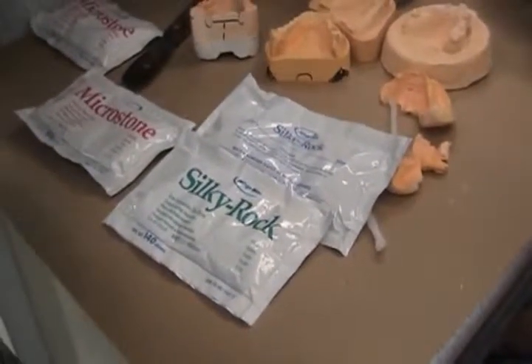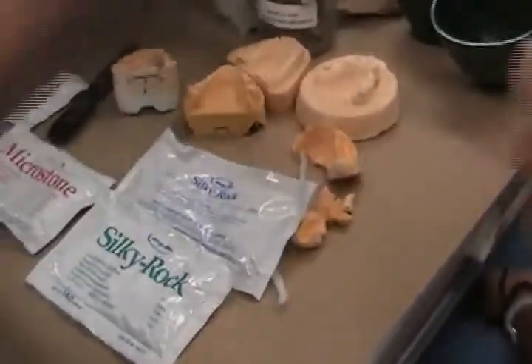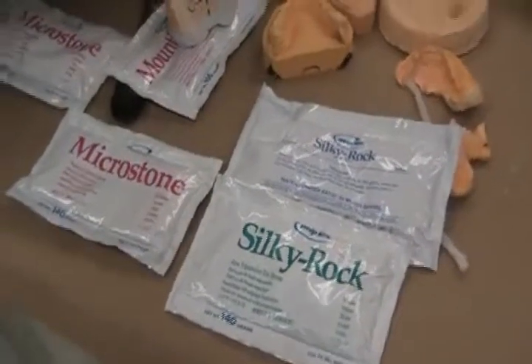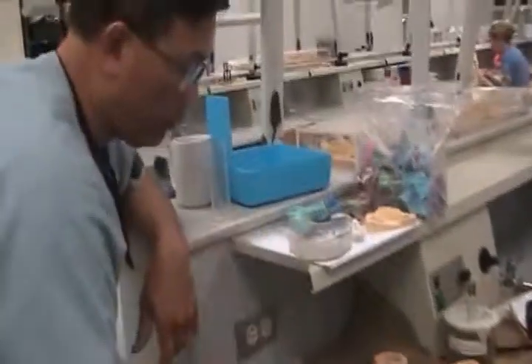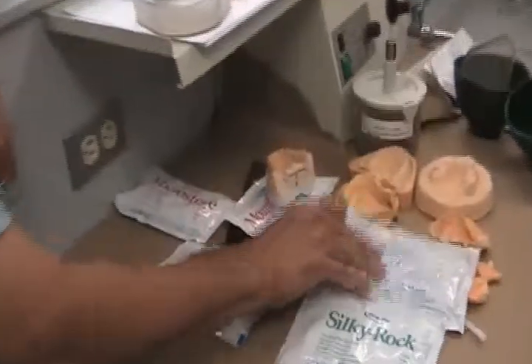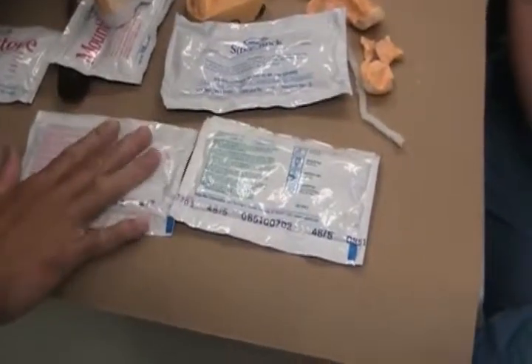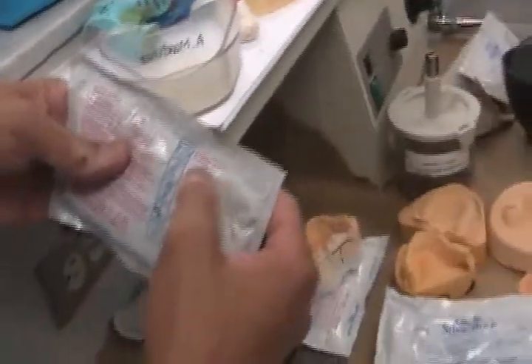I think we learned what was for what, but they never actually pointed out the packages — there was no connection. Each box has a vial so you can measure the prescribed amount of water. This is important: take time to read the back of the packaging, because it will tell you the characteristics, the use of the stone, and the water-to-powder ratio.